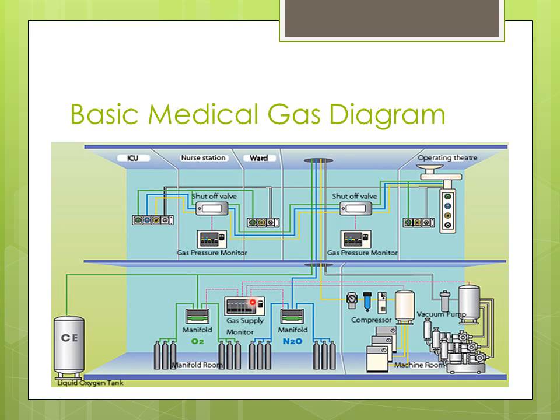The other thing, is it monitored? Well, not very likely. There's probably a very good chance that this gas monitor is not monitored 24/7 as is required, or in a location where it can be monitored. This is obviously a storage room, and there probably aren't people in here. Might be in engineering or something like that, but even then, is that monitored 24/7? That's one of those code requirements.